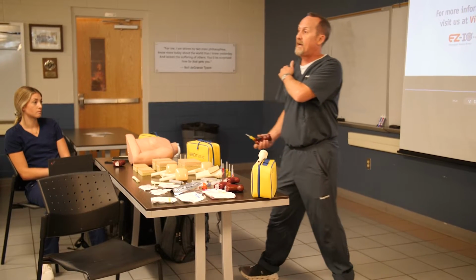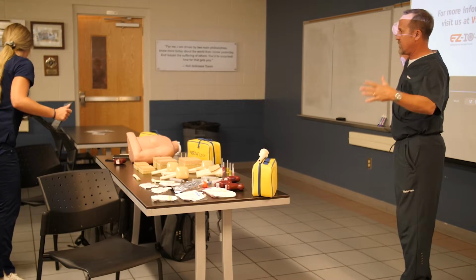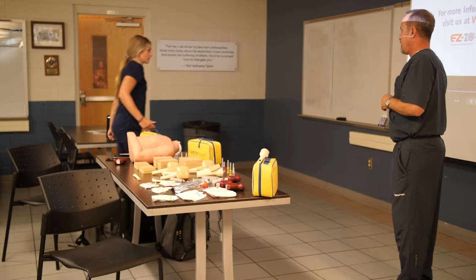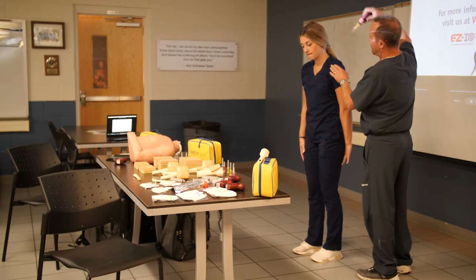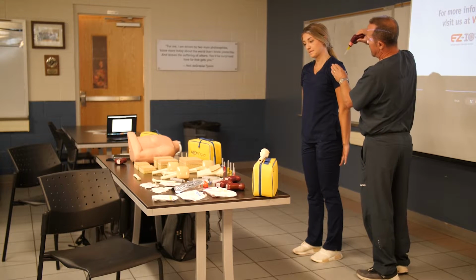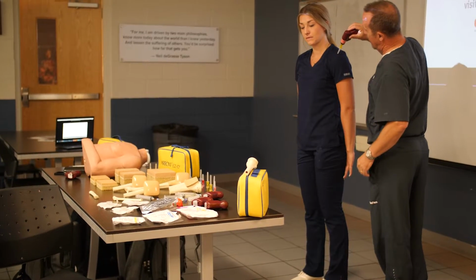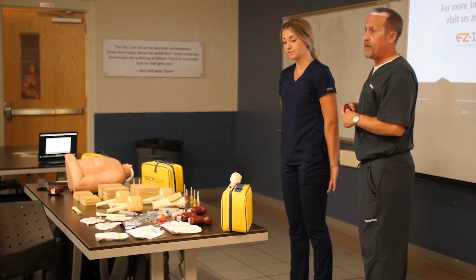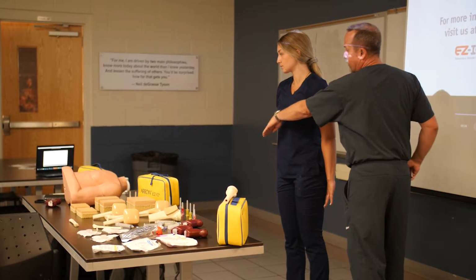What I mean by that is when we go into the proximal humerus, after we've landmarked that target area, will you come up here? I'm gonna be able to show instead of trying to do it on myself. When we landmark that area, we wanna go at a 45-degree angle from their head, and then about a 45-degree angle from the bed, okay? What I'm trying to achieve is, if that person had an imaginary seatbelt on, that's kind of the line that we're gonna go.